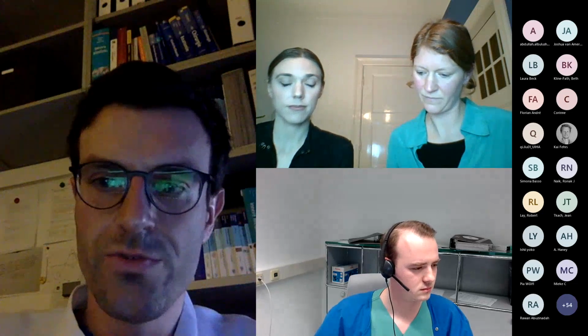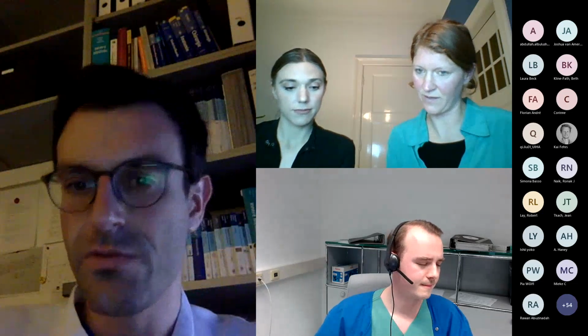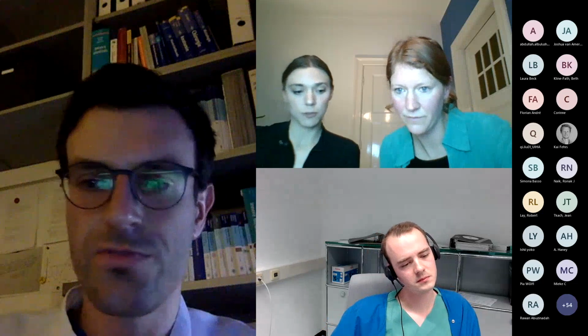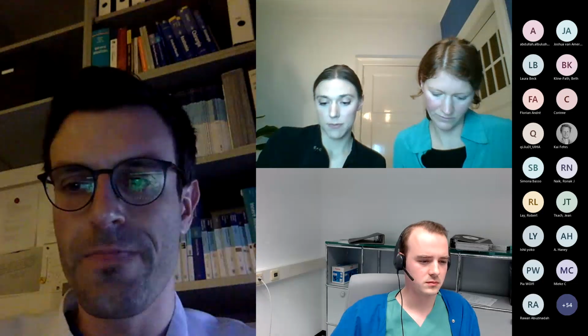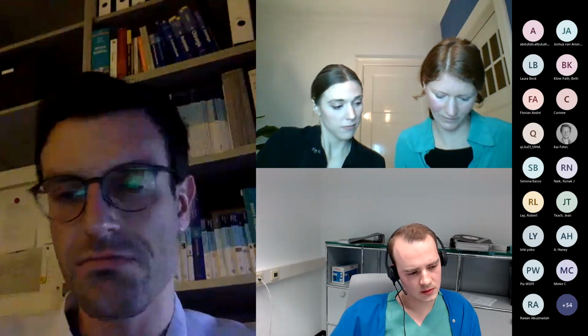Yeah. So we do prefer what the patient prefers. So if the patient is more comfortable with a certain breathing position, then we let her do what she wants. But it's important to get always the same level of breath hold, and if it's inspiration or expiration, I don't mind. I don't think this is much different. But as you said, Thomas is correct. Expiratory is more similar.